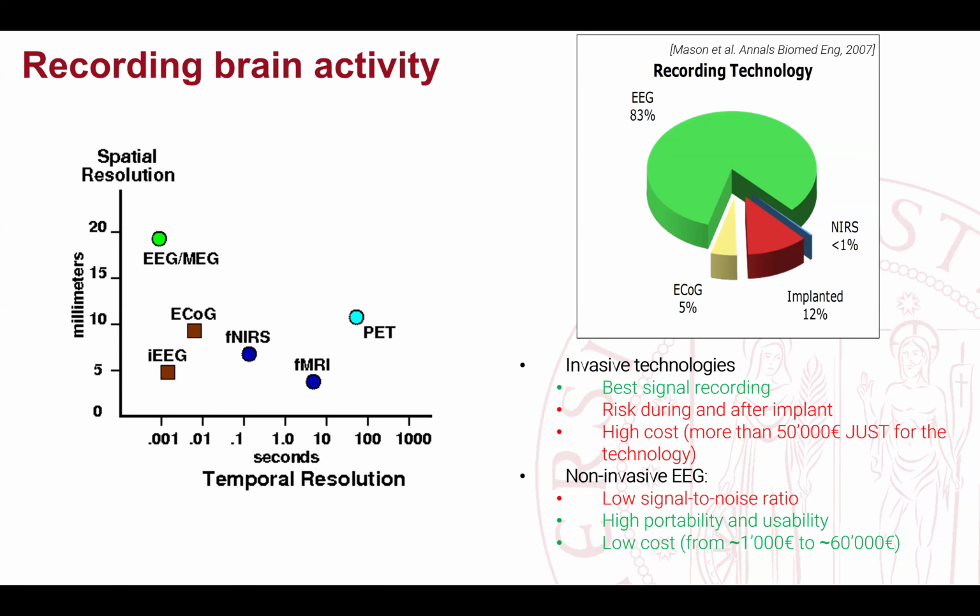We also have a tutorial. It's a bit more complicated because it requires real-time decoding, requires a little bit of C++, blah, blah, blah. But we have an online tutorial on how to implement an alpha BCI based on alpha modulation that you can use to have a simple switcher that works exactly like that. And it's, I think, 20 lines of code. So it's very, very simple. Not that simple to use, but simple to implement.